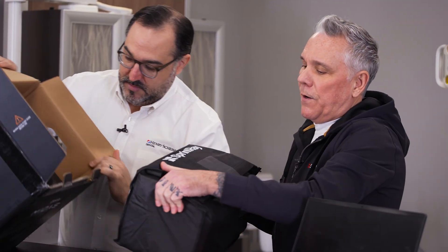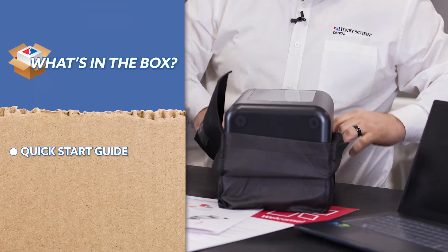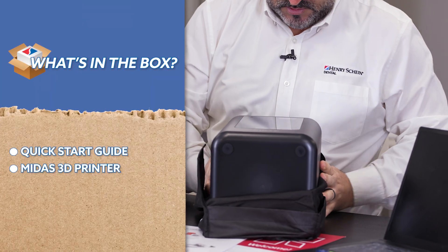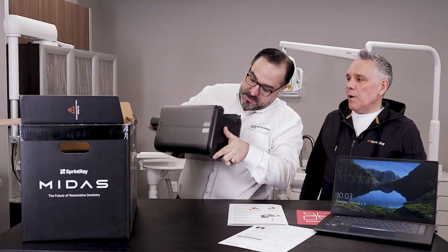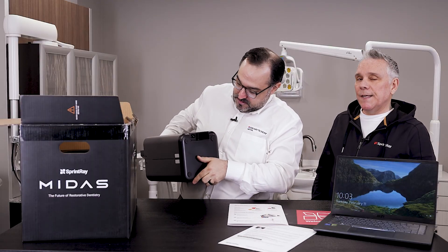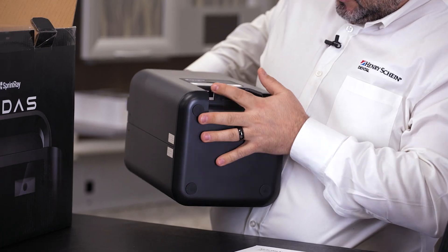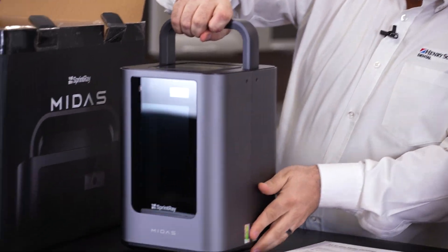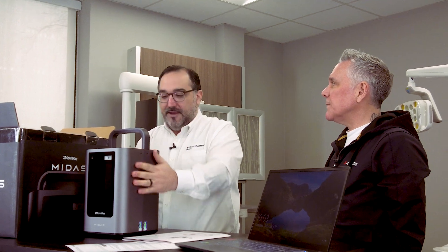As we take this out — wow — this is the printer, the whole thing. That's the Midas. So you see, this is everything. So we've got a screen here. We have a place for the plug, we have a place for data, so you can wire this directly in, or you can utilize Wi-Fi — whichever is preferable in your office. And the Wi-Fi is on board. That's not everybody doing that.